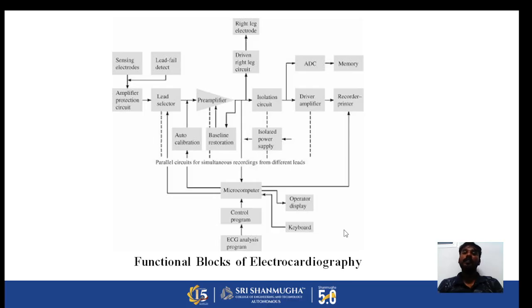There is an isolated power supply to power the machine, and there is a microcomputer. This is the major CPU of this electrocardiograph, along with the control program, ECG analysis program, operator display, keyboard, electrode and printer, which are the display items.